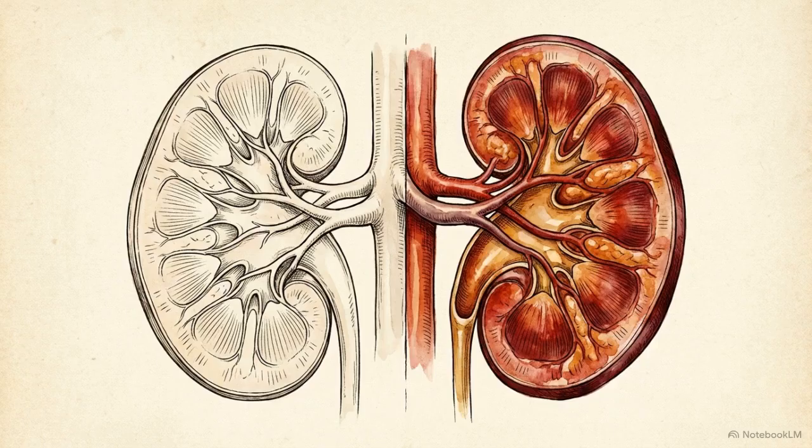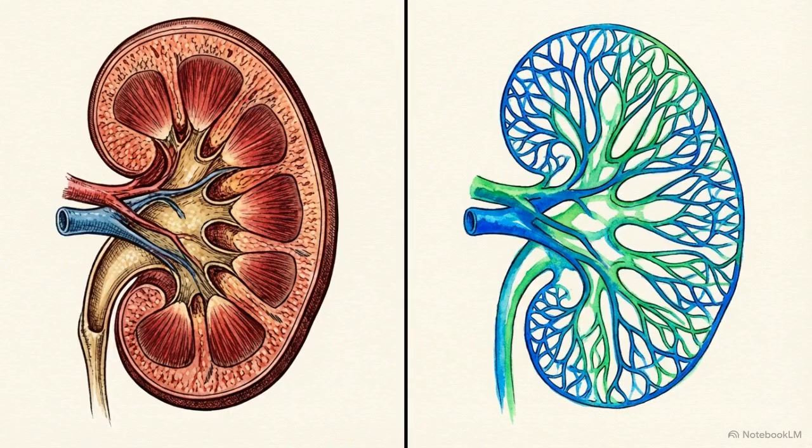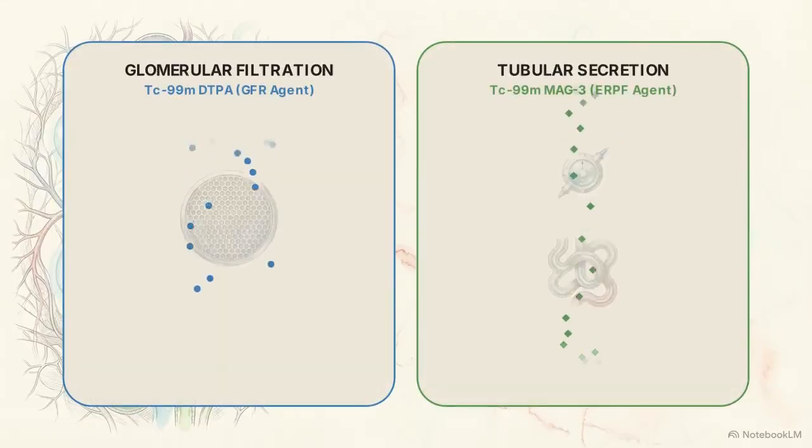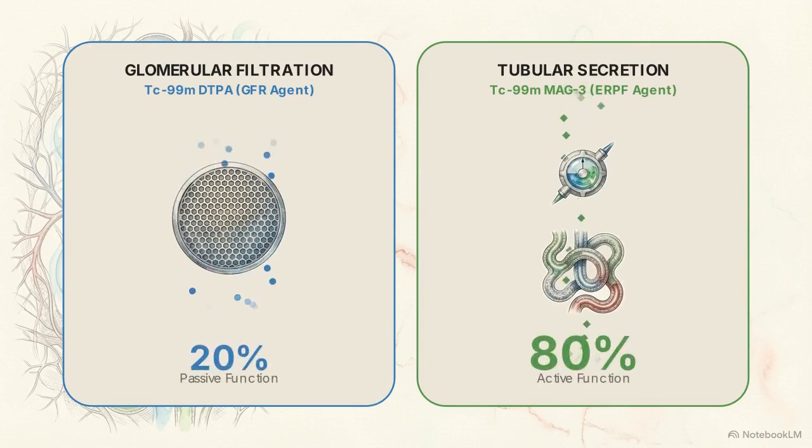Isolating perfusion timing from excretion timing is the only definitive way to separate a temporary ischemic shock from a terminal immunologic attack on the graft. Nuclear genitourinary imaging ignores structural mapping in favor of pure functional logic. Diagnostic accuracy begins with the tracer. You must match the exact chemical proxy, whether driven by tubular secretion or glomerular filtration, to the specific clinical question at hand.